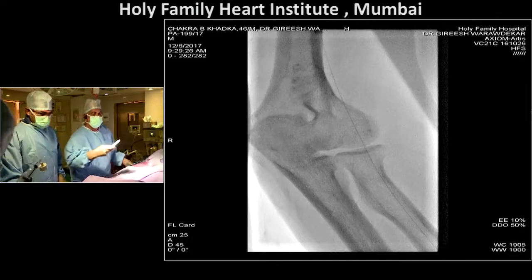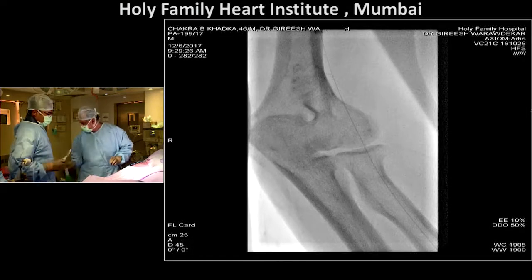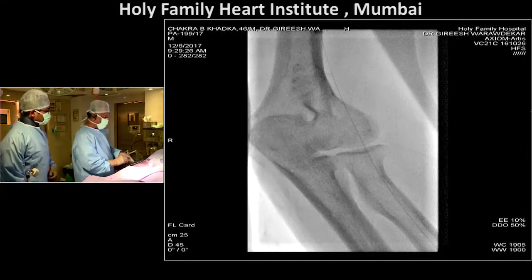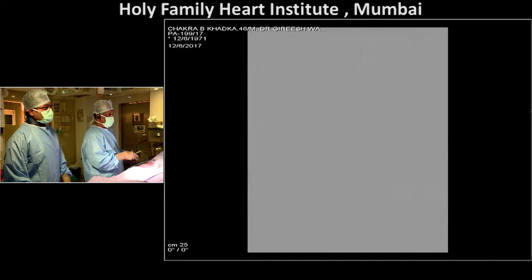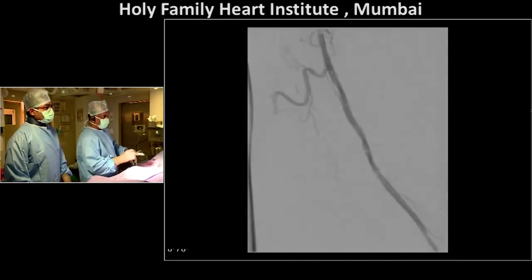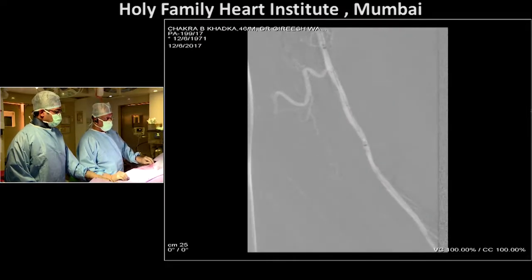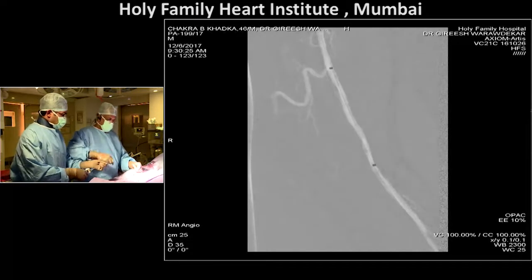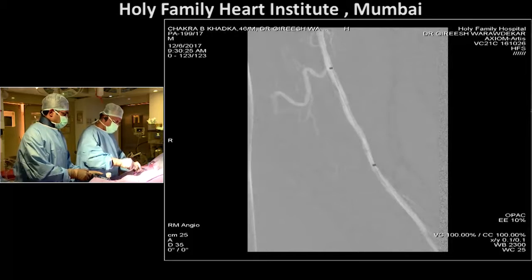Roadmap, please. Okay, so he is focusing on the picture. So basically, if you have a radial as well as brachial artery occlusion, obviously the brachial is being handled very well here. If there is an associated radial artery occlusion, probably I would go down there and look for the collaterals. If there are adequate collaterals with the increased perfusion pressure from the brachial, I would leave it. It's too small a vessel to handle there. But if that is not the case and the hand is ischemic, then probably I'll attempt a similar way, go down into the arch with my wire and try and bridge that with another balloon there.